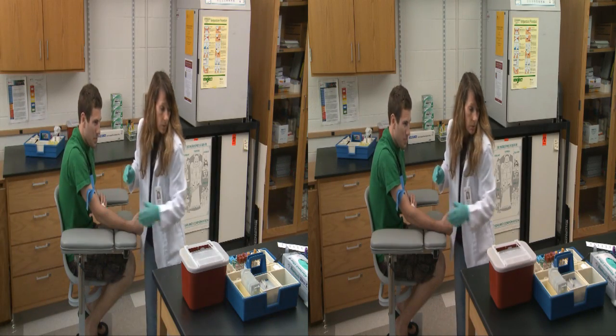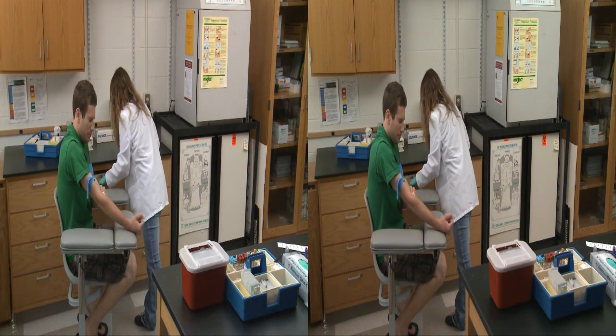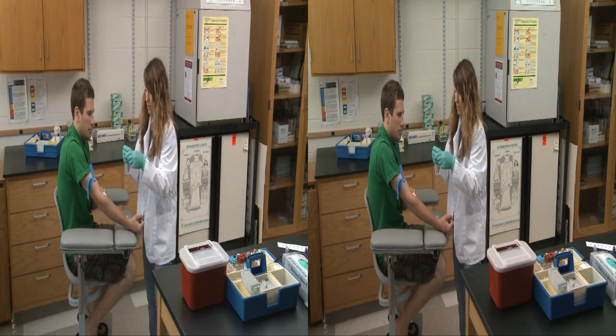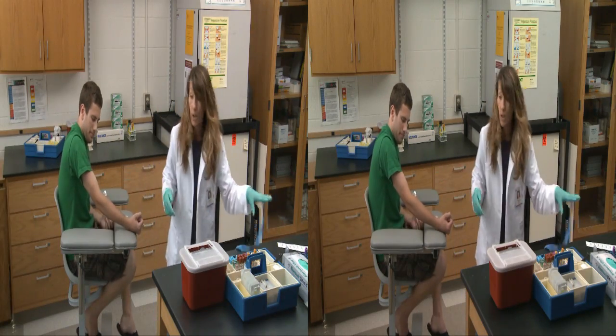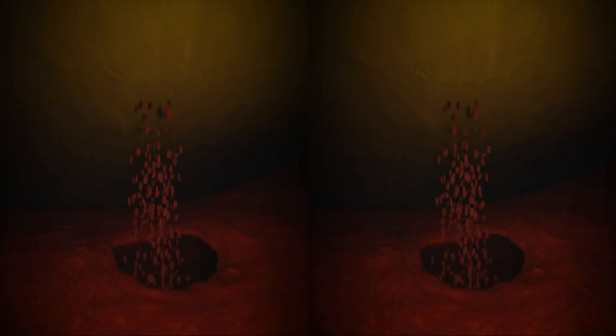All right, you're good to go. That's it? Yeah, I just need to put some tape on it. Good to go? Not necessarily. Failure to apply pressure on the puncture site immediately following removal of the needle can cause bleeding from the vein into the space around it, forming a hematoma — a collection of blood under the skin surface that will become bruised in appearance and painful to the touch.